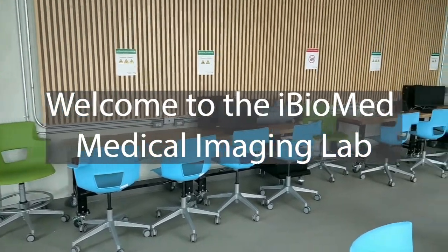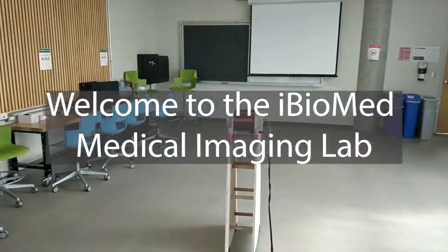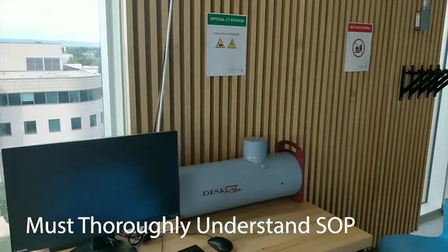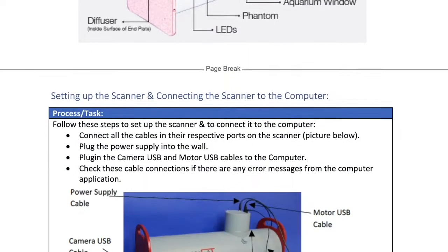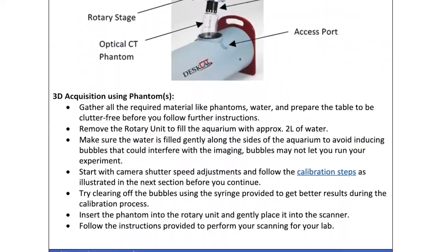As an iBioMed student, you will have the opportunity to work with the various lab equipment housed in our very own medical imaging lab. One of those pieces of equipment is the CT scanner. In order to take part in labs, you must thoroughly understand the standard operation procedures, also known as SOP, to ensure overall success, which can be found on your course website.